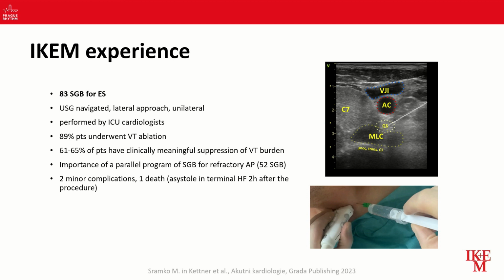Overall, from these 83 procedures, we had only 2 minor complications. However, we saw one death, which occurred in a patient with terminal heart failure who had repeated ablations, was receiving multiple antiarrhythmic medications, and 2 hours after the block procedure, he had asystole.